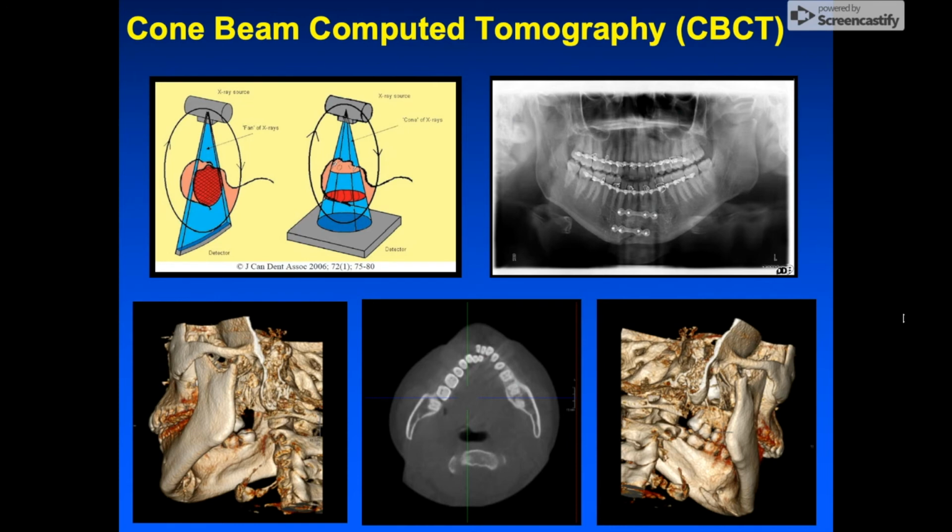It's a variation on traditional CT. It provides detailed images of the bone and is performed to evaluate diseases of the mandible, dentition, bony structures of the face, nasal cavity, and sinuses. It does not provide the full and diagnostic information available with conventional CT, particularly in the evaluation of soft tissue structures such as the muscle, lymph nodes, glands, and nerves. However, cone beam CT has the advantage of lower radiation exposure compared to the conventional CT.